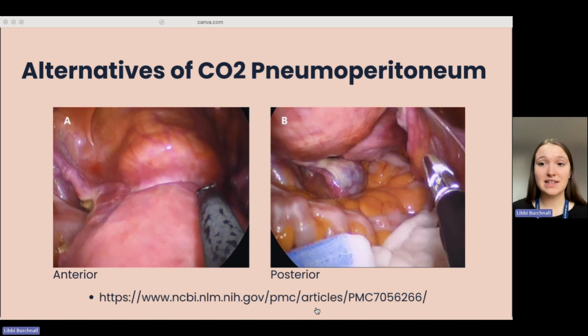Some of the things to consider is that there is slightly less space than in a conventional laparoscopic surgery. And you might get, say, bowels in the way. But some of the things to combat that might be using bowel prep before, and also considering the surgery for people with, say, a lower BMI, so that you can maximise the amount of space that you've got in the abdomen.